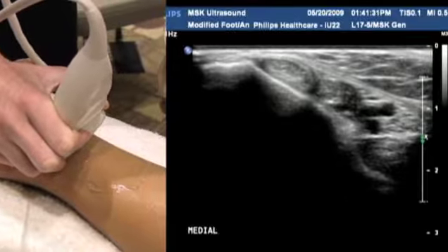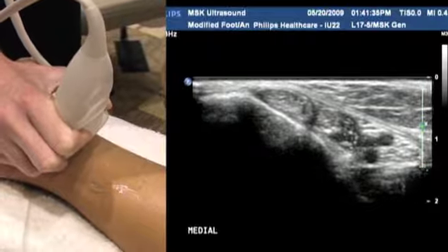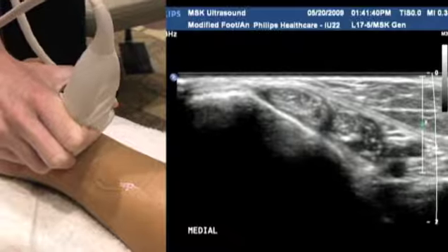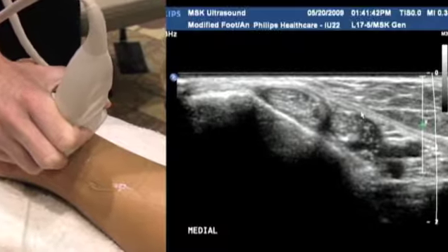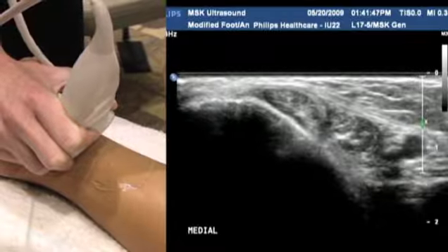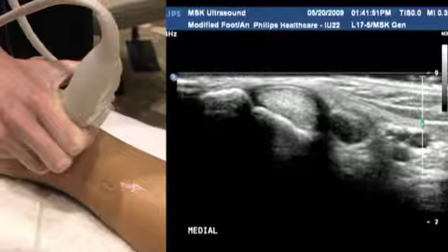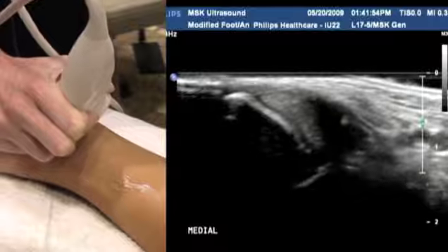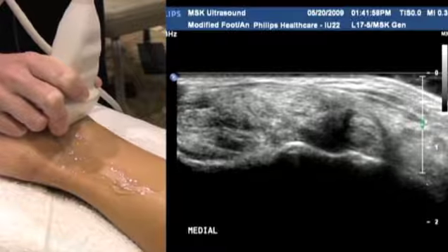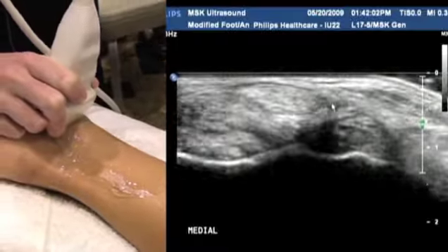So let's go and focus on our tendons now. Let's look at the posterior tibial tendon, first of all. It's the guy right at the top here, right here. Okay. Again, we're going to start quite proximally and we're going to follow it all the way down, again, heel toeing as we go, making sure it stays nice and echogenic. As it goes around the malleolus, it can be difficult. Again, underneath the retinaculum that you can see here. Following it all the way down distally.